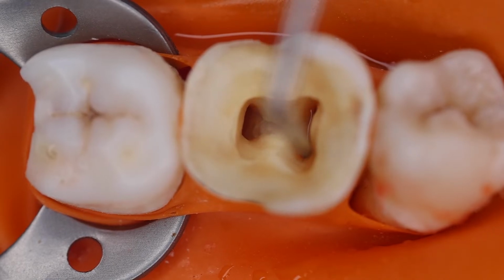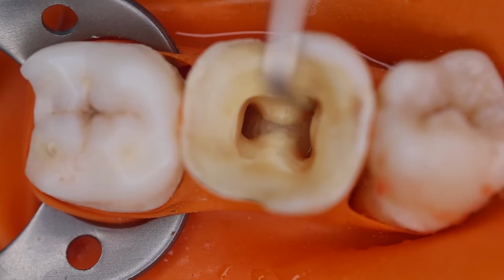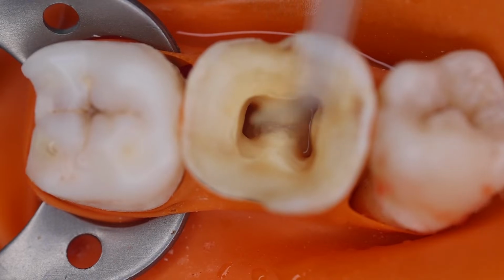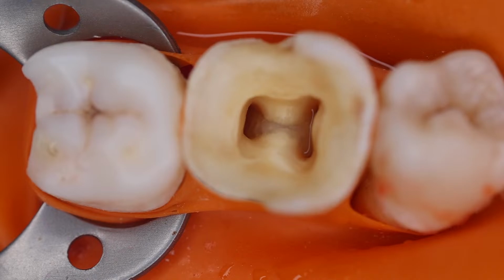Similarly, in the mesobuccal canal we got 19, so 18 millimeter is the working preparation. And the 18 millimeter reading in the mesolingual canal means 17 millimeter would be our working preparation. So hope you were able to understand the concept of the electronic apex locator, and this is how we need to prepare the canals.